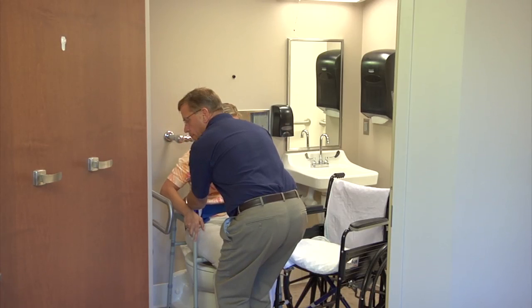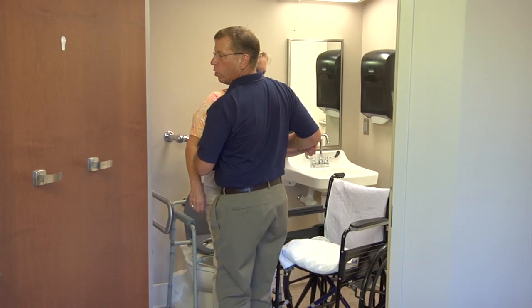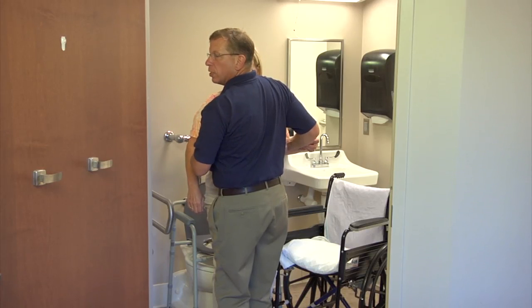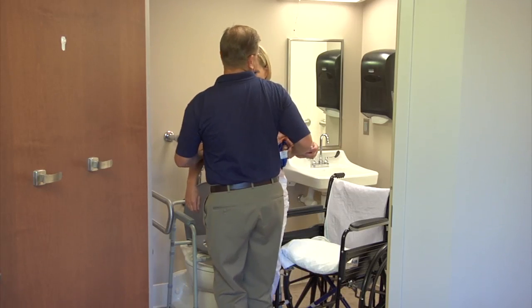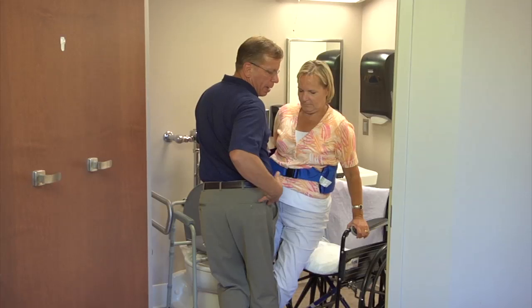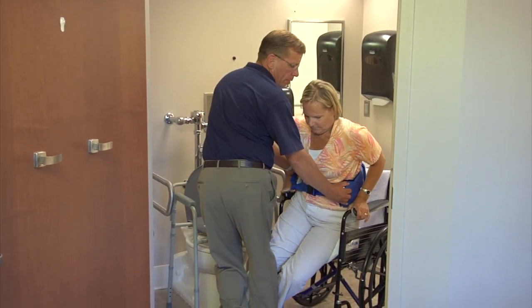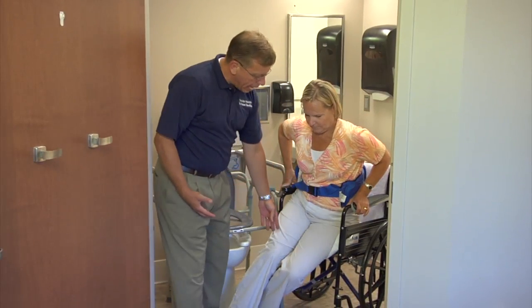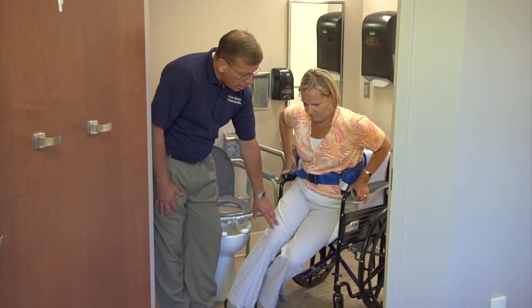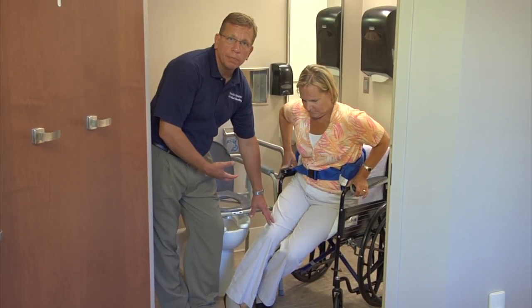We're going to try to stand her up. As we stand, you can see the leveraging on my spine if she does not have good trunk control. And then what we're going to try to do is pivot into the chair while stabilizing or blocking her right knee. Reach back for the chair. Notice in this position the twisting of my spine, the rotation of her knee as she goes to sit. Over a period of time, what can happen is, due to this twisting, the knee becomes swollen. It also can be very painful and present with a loss of motion.